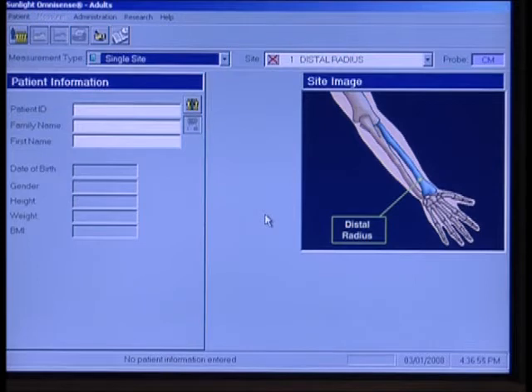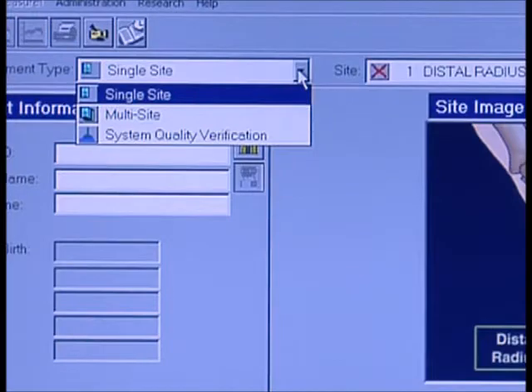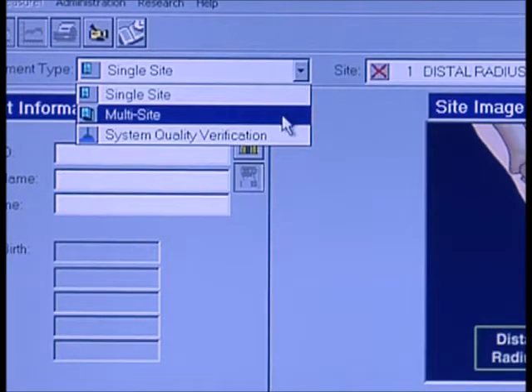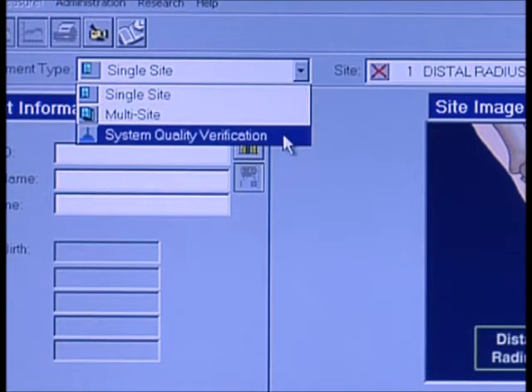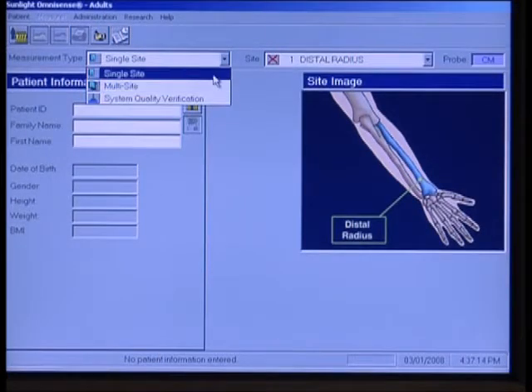Now let's look at what we have on the desktop. Let's start with the measurement type. You see we have three choices from the drop-down list: single site, multi-site, or system quality verification. For our purposes we're going to be using either single site or system quality verification.